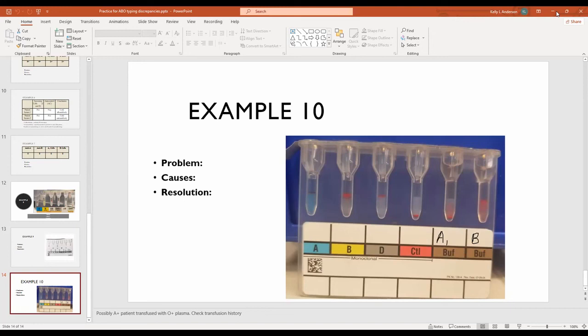So why not do an elution, to look and see what's underneath? Because it's a 20-second immediate spin. An elution is like an hour-long process. So you want to make things as simple as possible. An elution costs money too, because it's a kit. No reason to do an elution, because there's nothing sticking to it. If you did an elution on this, there'd be nothing there, because there's no antibody present. An elution is just going to elute off antibodies on the cell.